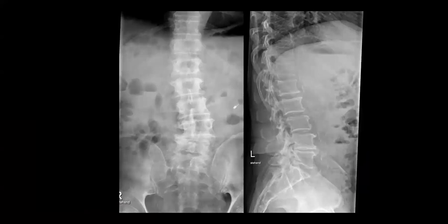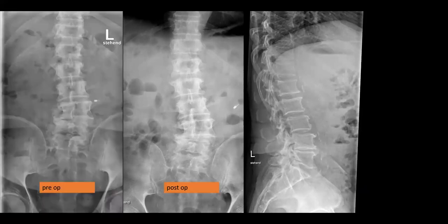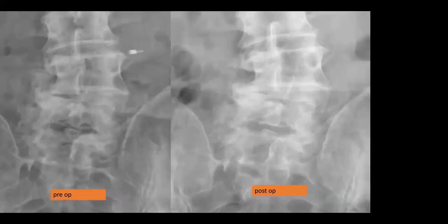This is the post-op image. The coronal deformity is still present. I didn't touch it. It was not changed at all by the surgery. And this was pre-op. If you compare pre-op and post-op, have a closer view, you can see here what I've taken away. Counting is very easy. Here you see L4-5 is the one with the right narrowed foramen. And this is the bone I took away just to get into the foramen.